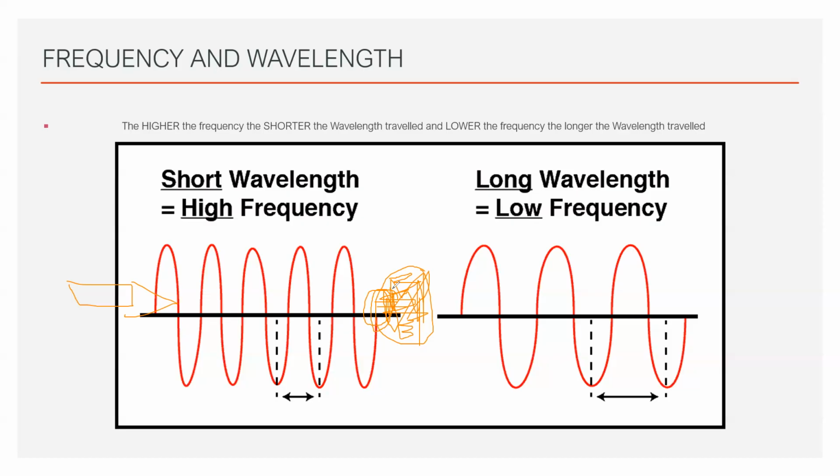But naturally, if you wanted to look at the deeper areas of the brain distally, then actually you'll run into trouble. And a very good example, again, if this is the brain and these are the meninges and this is the ventricular space. Now, if you use a high frequency probe, you'll be able to see the superficial areas very nicely, but those deeper areas will not have good resolution, might appear blurred, and not really give you the delineation that's needed to make a clinical diagnosis.